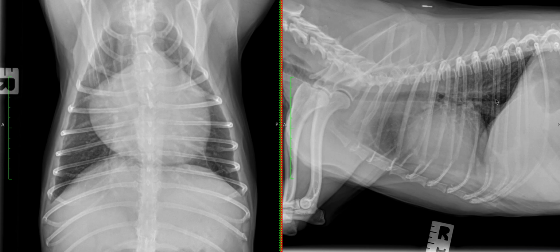Our next steps for this patient include an electrocardiogram, or EKG, and an echocardiogram. A TFAST in this patient identified that there was anechoic fluid surrounding the heart. Causes of pericardial effusion are variable.